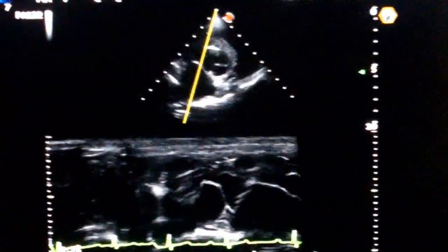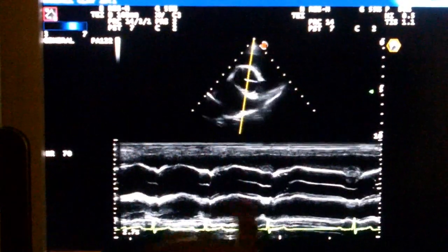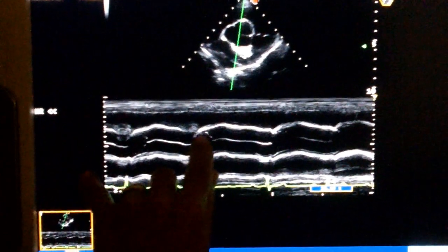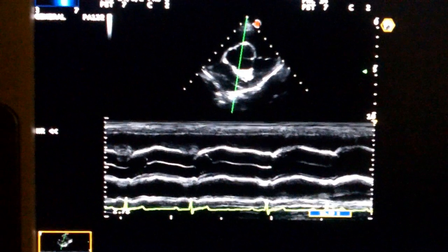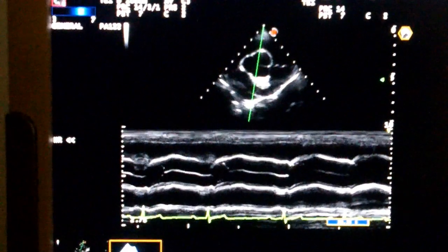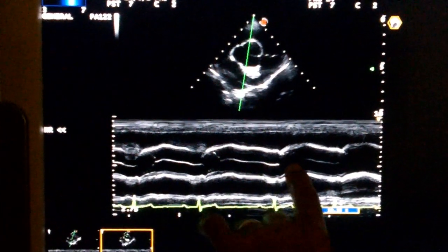For this case, we're not seeing too much as far as anything else — looking for significant patterns of hypertrophy. That looks pretty good. You can really see that image is just so clear. You can see full aortic valve opening and closure. We can see a little flutter right here in the leaflet, and that's probably due to some of the activity in the mitral valve causing the aortic valve to flutter.